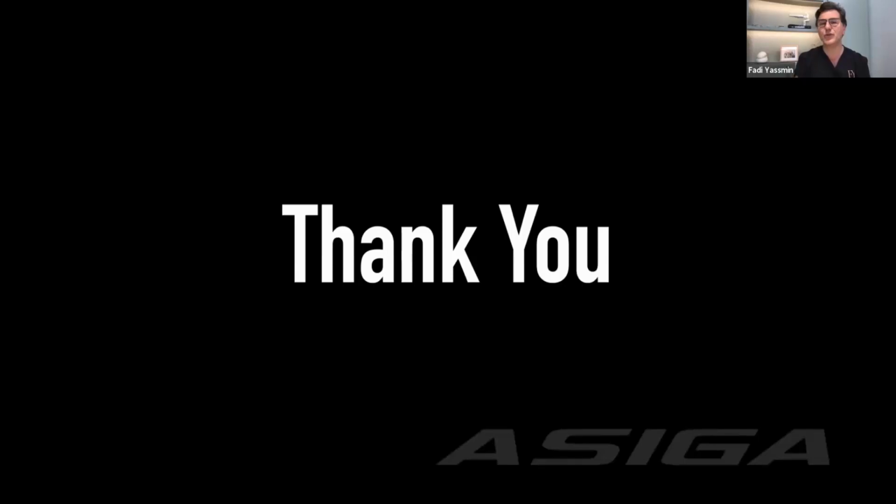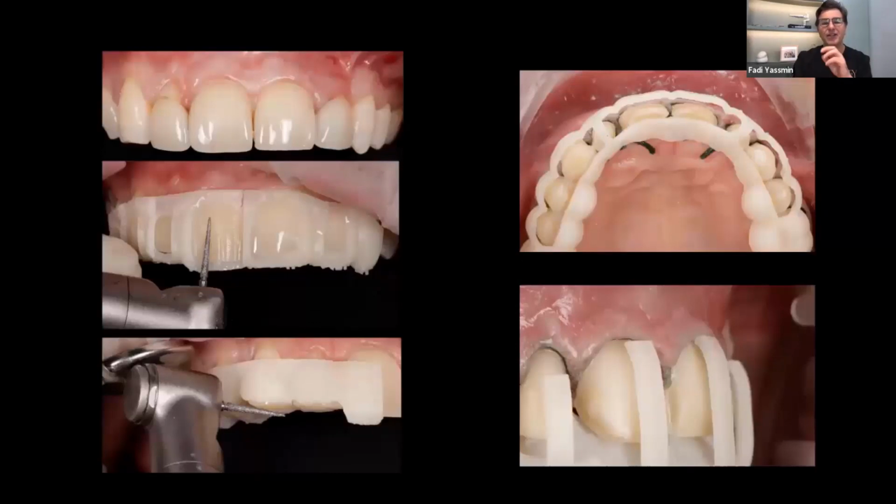And you saw some of those guides, and I can go back to some of these photos. In this particular photo, you can see these little guides. The bottom left is designed so I can trim the edge of the tooth to the ideal position, and I don't have to think about it. The one above trims it back so that the next guide sits on it. So these guides on the left have to be done before I can place the other guides. So it's sequential preparation guides.